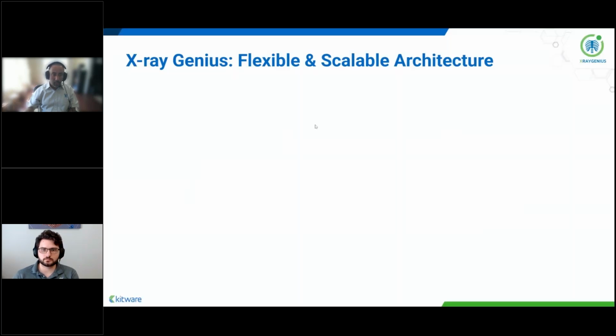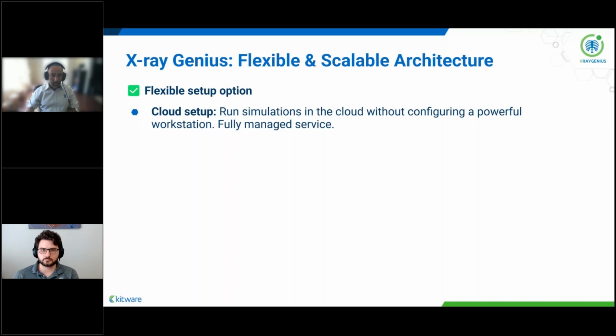All right. So just a little bit before we dive into the live demo, I want to take a moment to talk about the architecture. As you will see, we designed X-Ray Genius to be flexible and scalable. The reason being is that our users and people who are interested in using X-Ray Genius have different configurations.